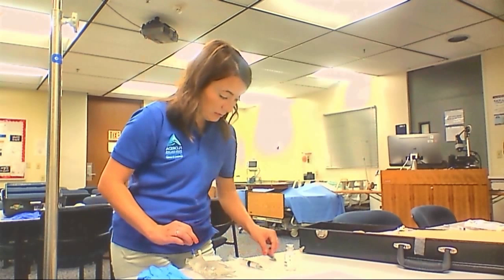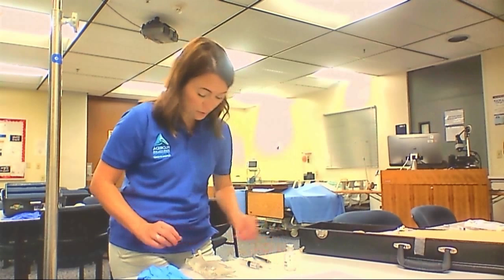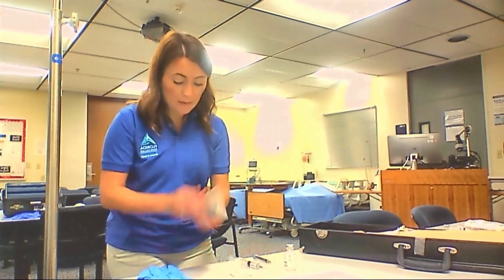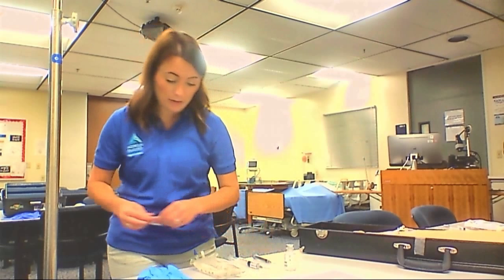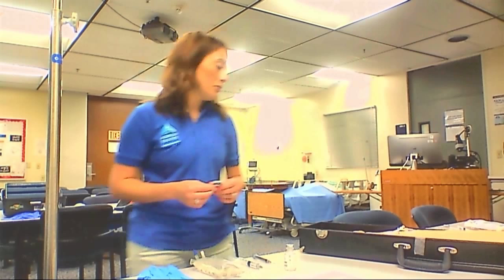Using the scoop method, I will recap that needle to make sure that I don't stick myself. Then I'm going to mix the medication like so, versus shaking it, to minimize the risk of bubbles. I also want to label my medication bag with the client's name, the drug dose, time of administration, and my initials before I hang the bag.